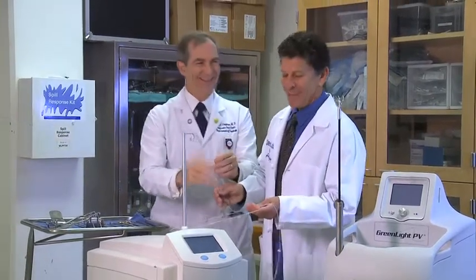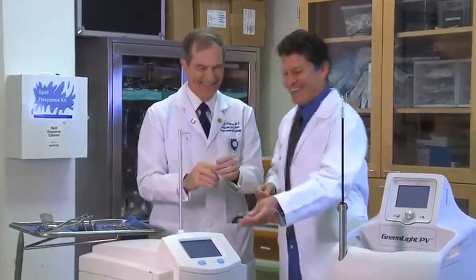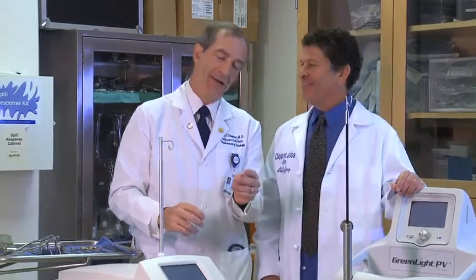Okay. Maybe considering you are ready to go here, I'm going to stand back just a little bit while you describe this. This is a laser fiber, okay? These things can be as small as 200 microns, so it can be as small as a human hair. We now have endoscopes, little tiny scopes that we can look through that are completely flexible. You can take that endoscope and travel across the urethra, across the bladder, into the ureter, up the ureter, all the way into somebody's kidney.